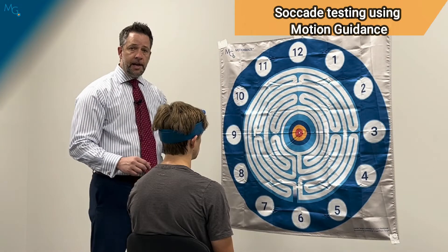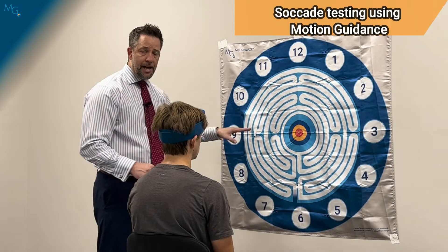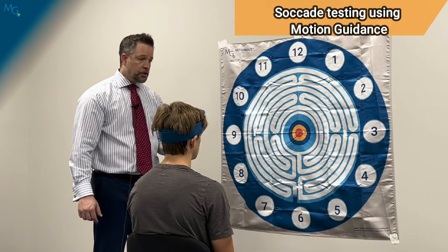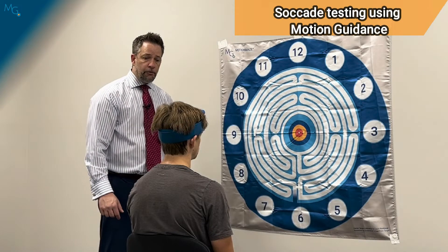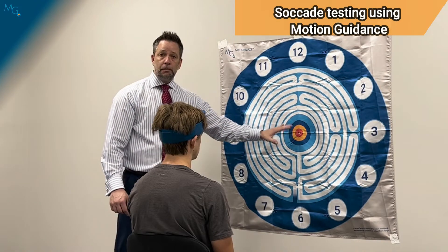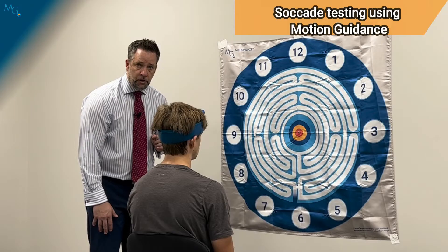To perform this test, we're going to have the patient look as quickly as they can between the nine and the three on the horizontal axis without moving their head. After I've centered up the laser, I'm going to ask my patient to look to the nine and to the three, back and forth without moving their head. I might cue them to not stop in the middle, but just go back and forth between the two numbers. This allows me to watch his eyes and also see if the laser is starting to move.